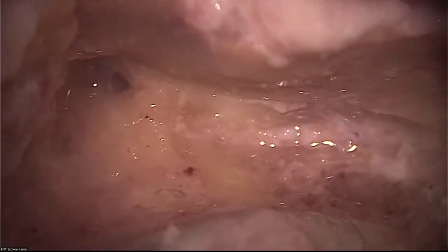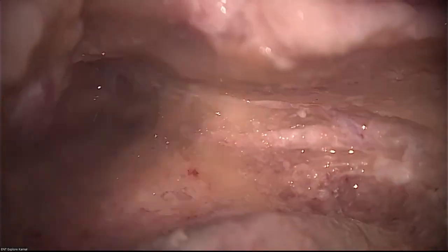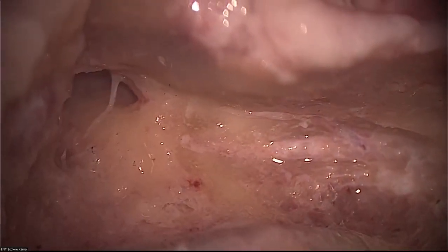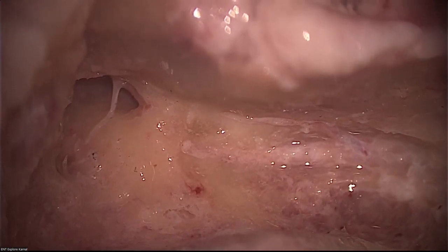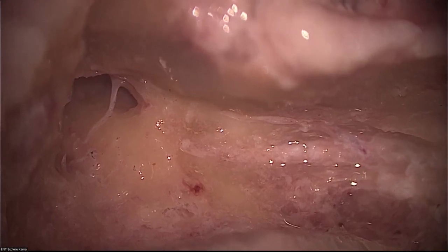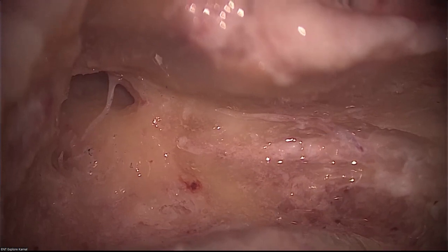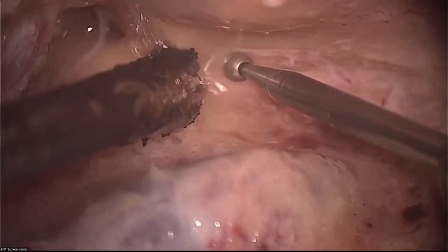Can you center the picture, boss? Can you see the space between the chorda and the facial nerve? Better. And the space between these two is going to be the facial recess. See both the nerves, so clear. And see the incus and the relationship of the facial nerve. The facial nerve is always deep to the plane of the incus. Always. Use the landmarks which are more reliable.